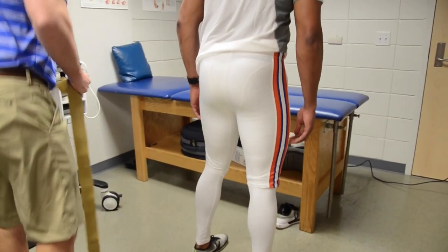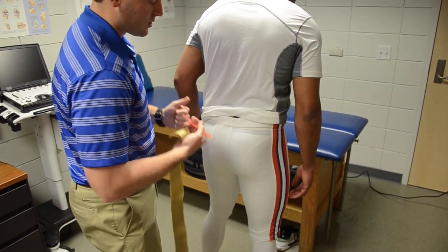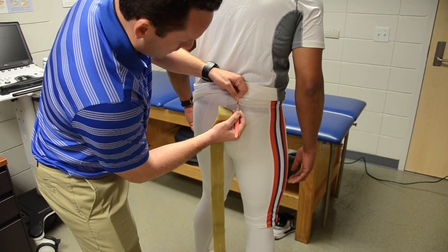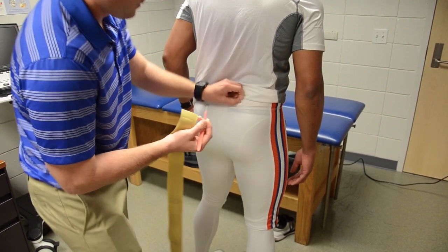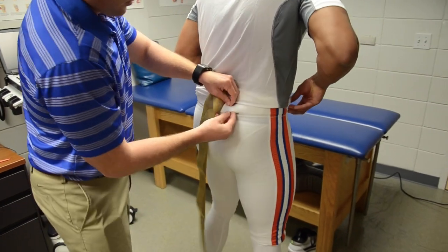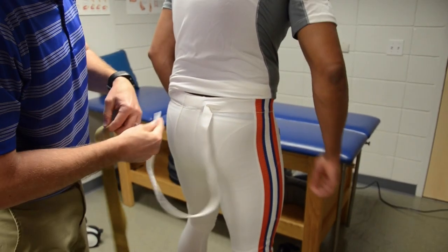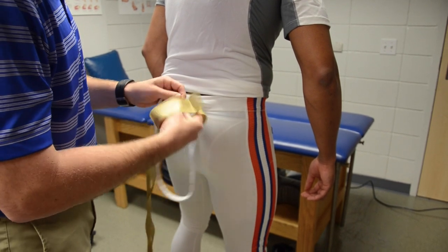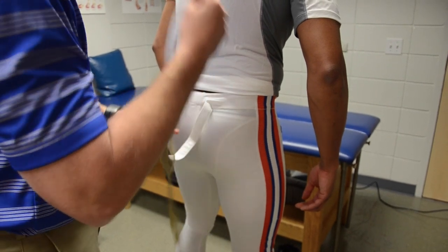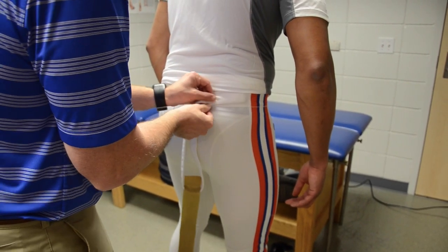The next step, depending on the pant that you wear — you can even do this with shorts. If an athlete has shorts on, you can just put a belt on and hook it into the belt. But for these pants, we'll actually slice a little hole here. We'll pull the belt through and hook the CLX up. I like to leave a little bit more of that seam on there just so it doesn't break. So we'll come through here, lock it in. This is a little bit tricky — just going to feed it around through.